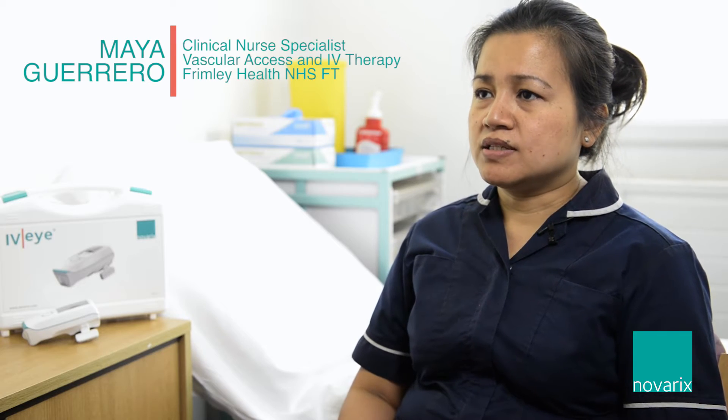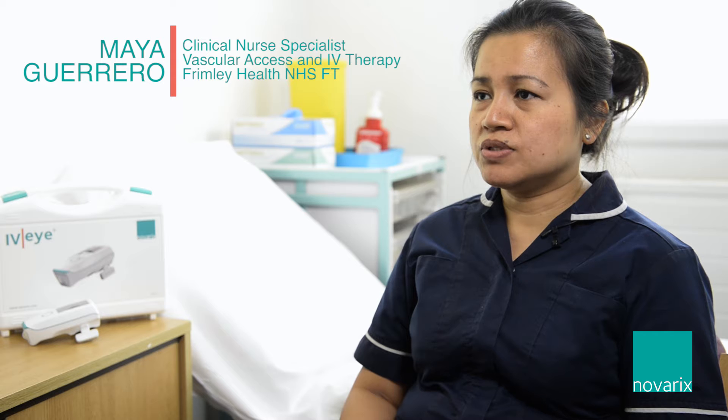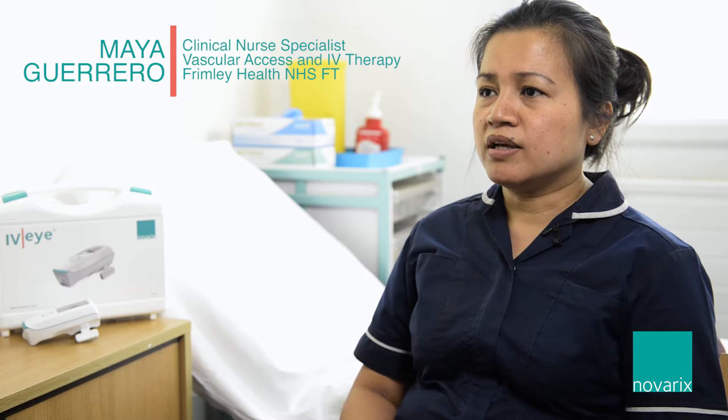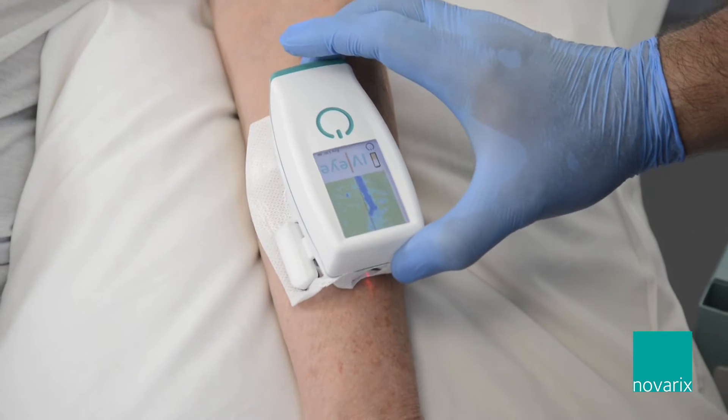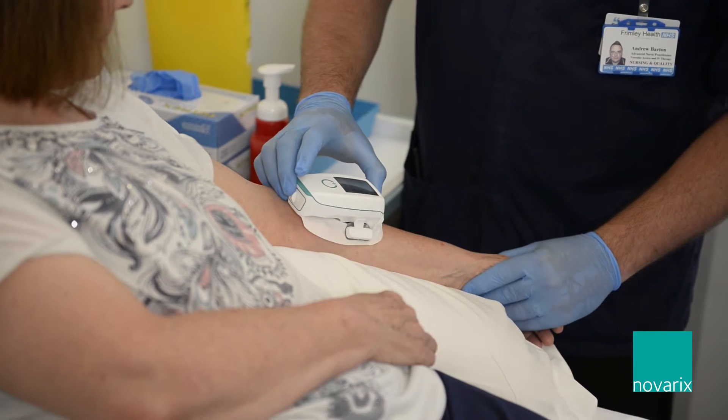The thing I like about the IVI is that it's portable, it's easy to use, and it's also reliable. I can visualise the vein more easily, and it saves me time because I can easily cannulate on the first attempt.